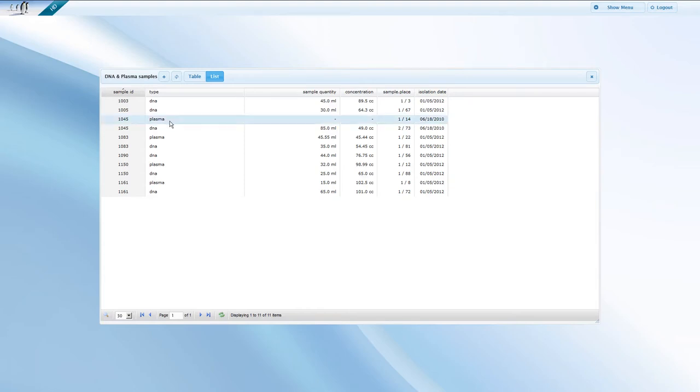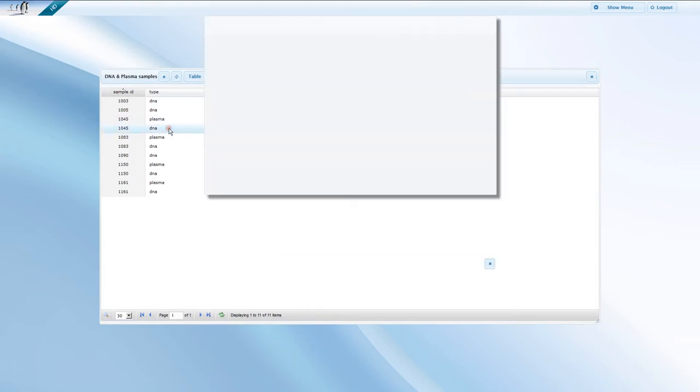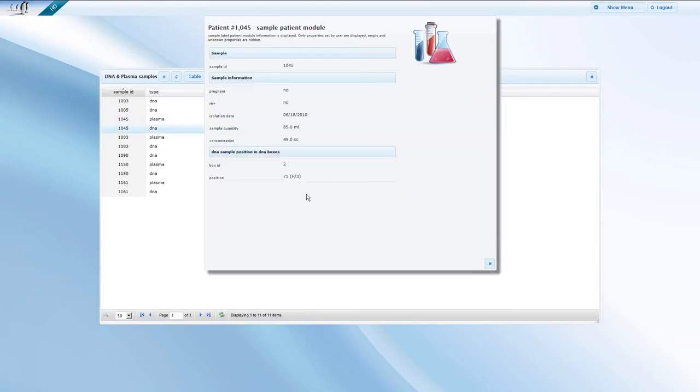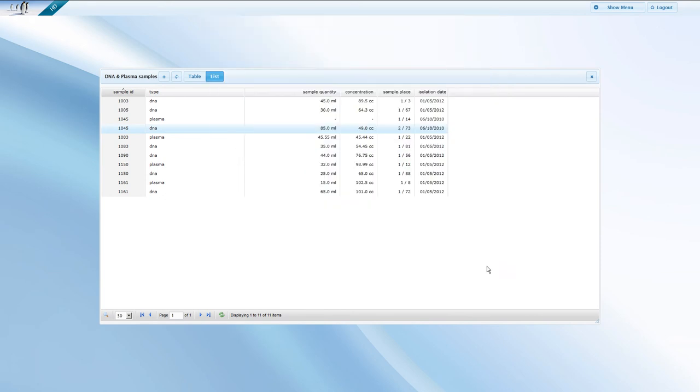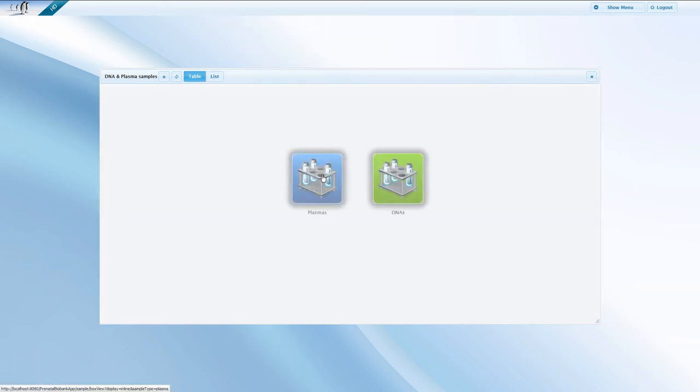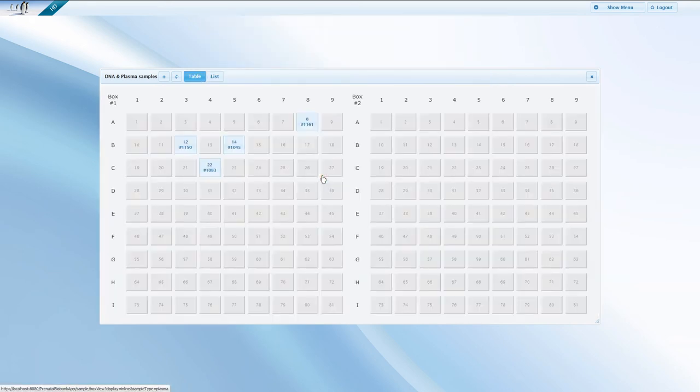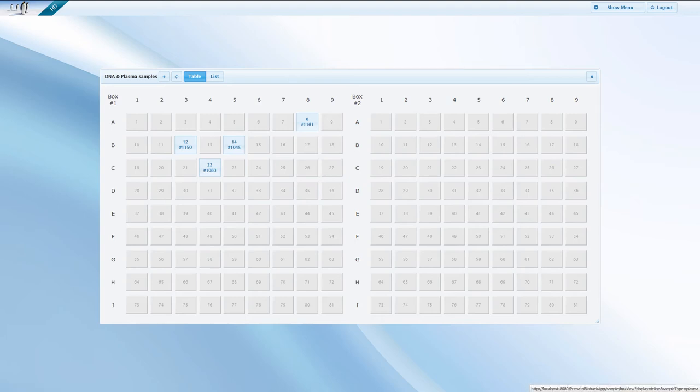You can check the details of a particular sample by simply clicking on it in the list. Just like patients, samples can also be displayed in a table format. In this view, samples are shown as they are stored in the container.